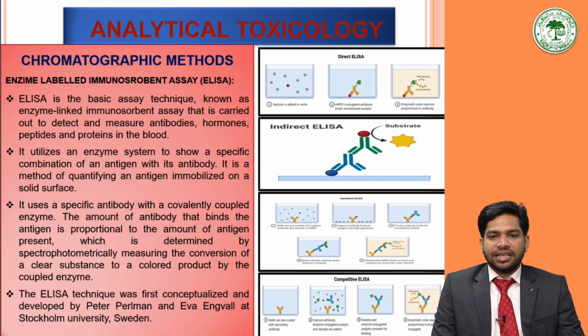Then competitive assays. They are of two types, homogeneous and heterogeneous immunoreaction, depending upon the solution in which they are placed. In the homogeneous, the solution is homogeneous. In the heterogeneous competitive assay, the solution is heterogeneous. Competitive homogeneous immunoassay: here the drug X is to be measured, then antibody against the X is prepared and bound to a solid phase as in the sandwich assays that I told you above.